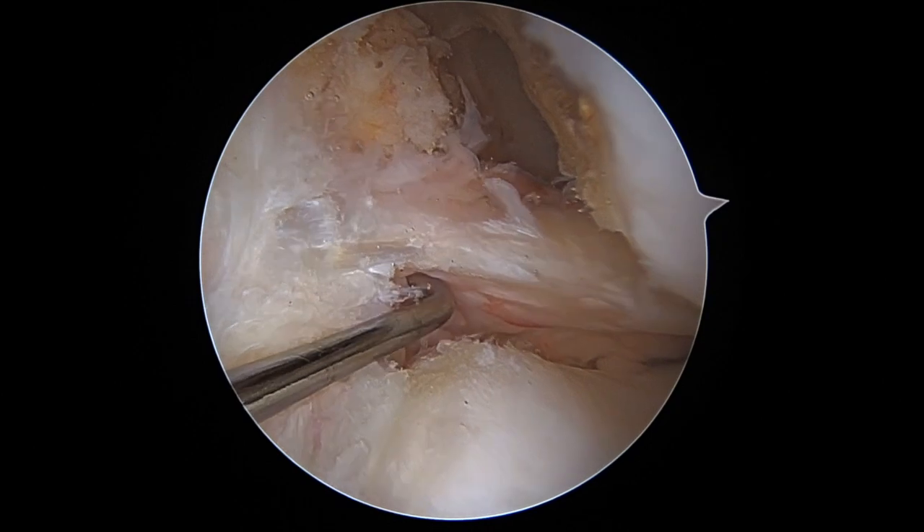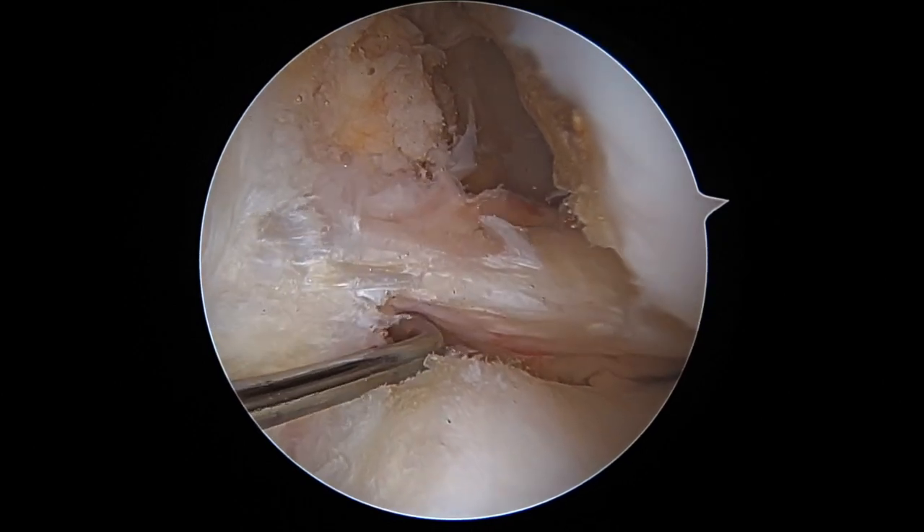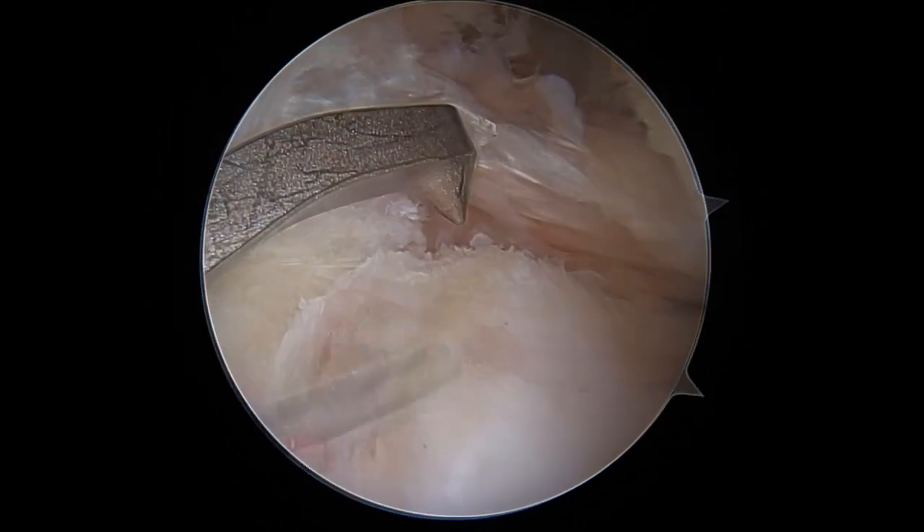A standard diagnostic arthroscopy of the left knee is performed in the supine position, revealing a posterior lateral meniscal root tear.